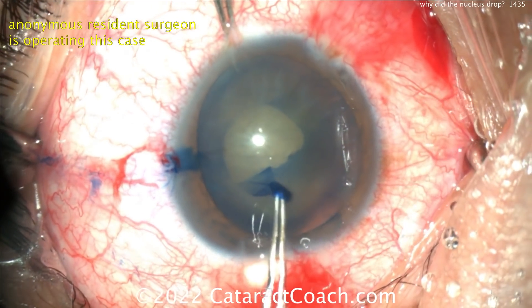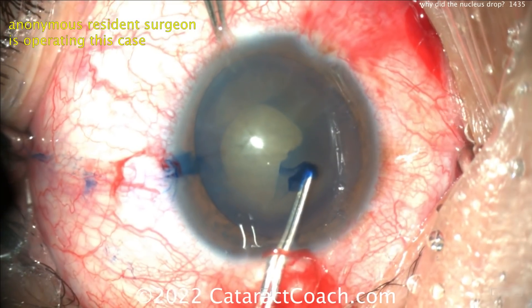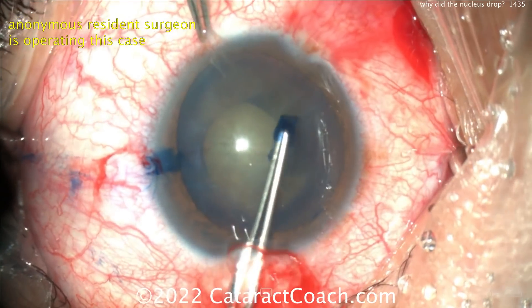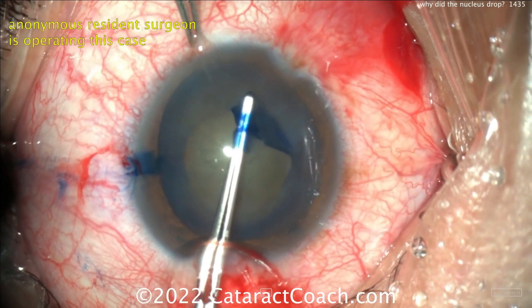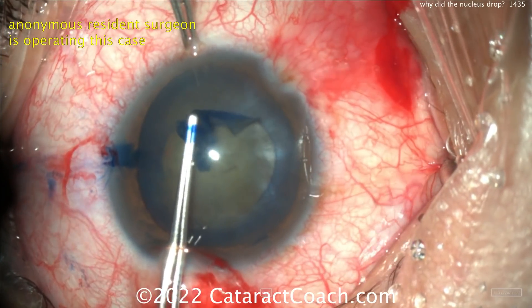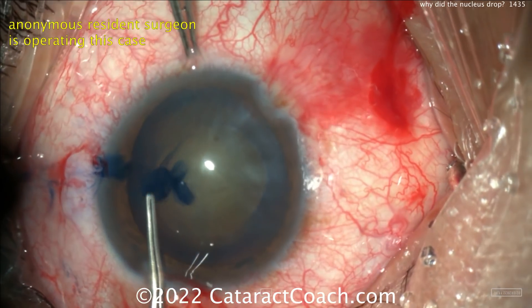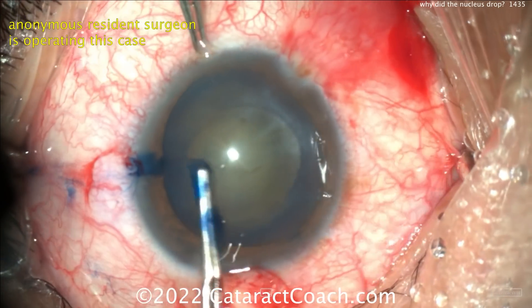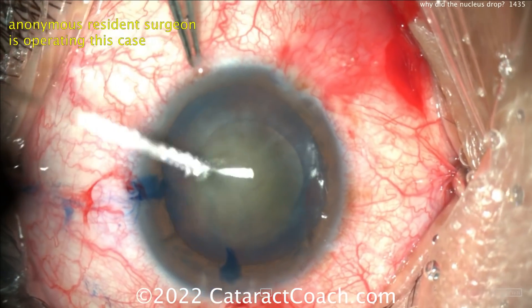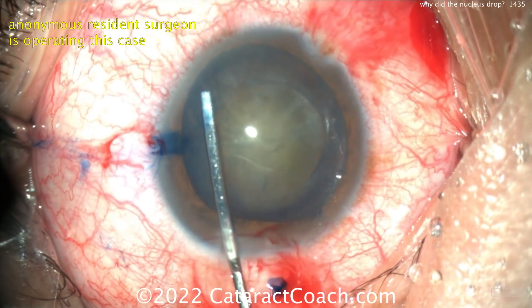You can have patients with weak tissues. We've shown videos here in the past where patients had prior intravitreal injections which damaged their posterior lens capsule, and then during cataract surgery, there goes the nucleus. When the nucleus does start to drop into the vitreous cavity, let it go — it's okay. This is why we share the love and the liability with our vitreoretinal colleagues. So let's watch what happens here.